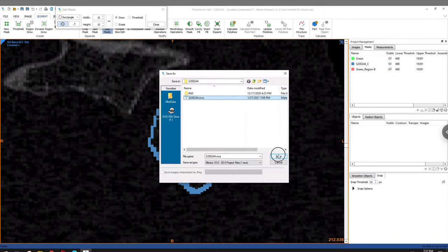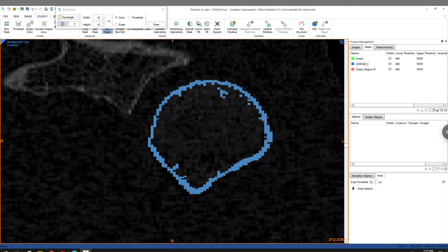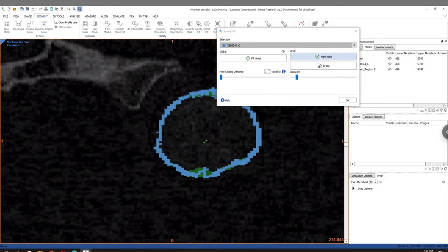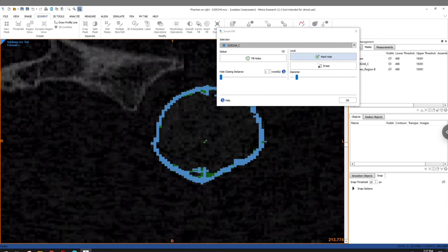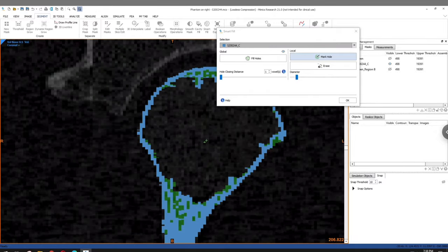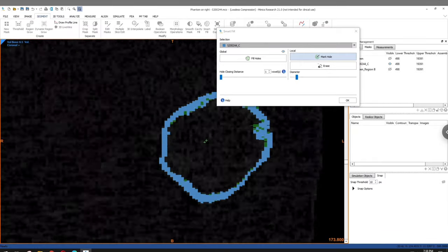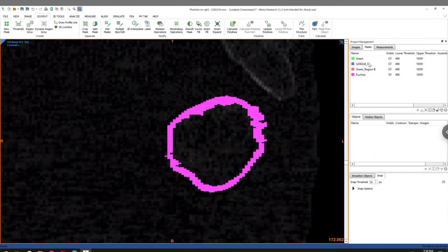As with any large project, make sure you save after you've completed any large steps. And as you can see here, I'm going to be using a native function within Mimics to automatically, or at least attempt to automatically, fill any gaps or voids in my cortical shell. As much as I would suggest this process, I'm still not sure how effective it is. In some cases, depending on the overall speed and power of your computer, it may take a substantially long time, so it might be worth just skipping this step.